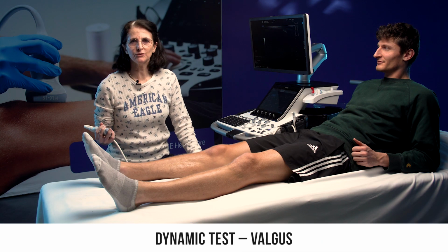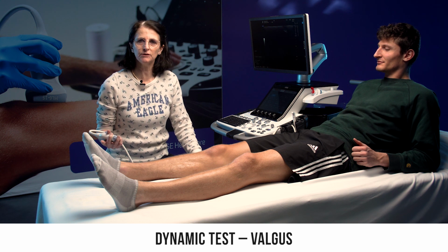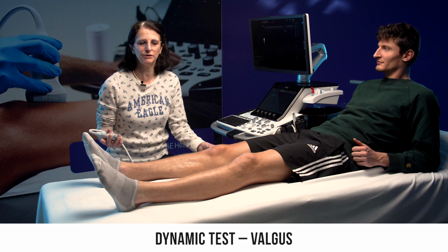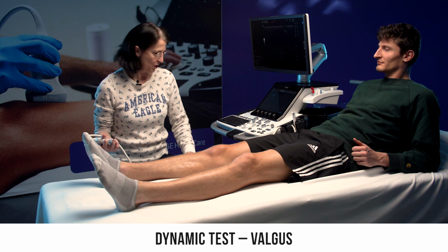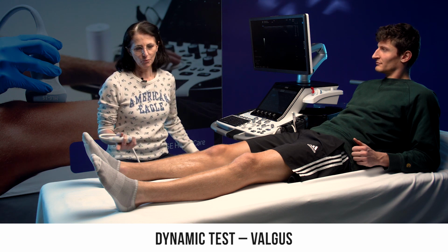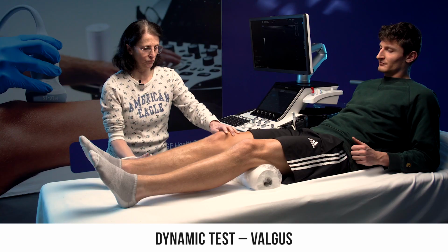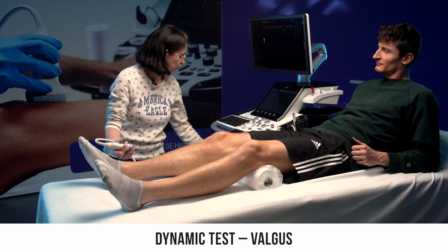In the context of suspected medial collateral ligament sprains, we can use a dynamic maneuver to differentiate between grade 2, where the ligament is still continuous, and grade 3, where it is actually torn. This is the valgus stress test that clinicians know well. To do it, the knee must be unlocked, so place a bolster or rolled towel, whatever you want, to flex the knee slightly and unlock it.